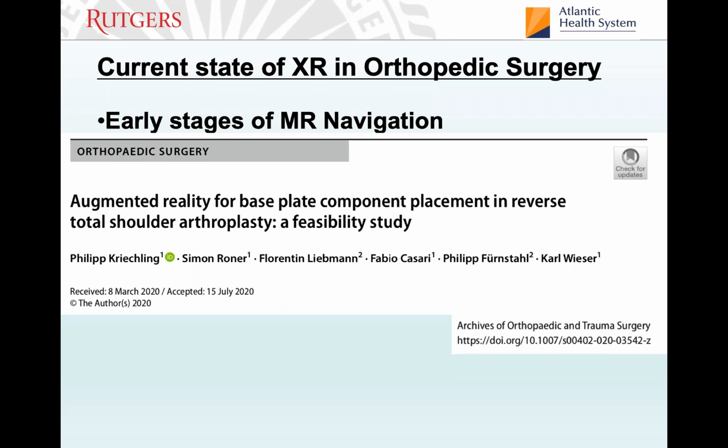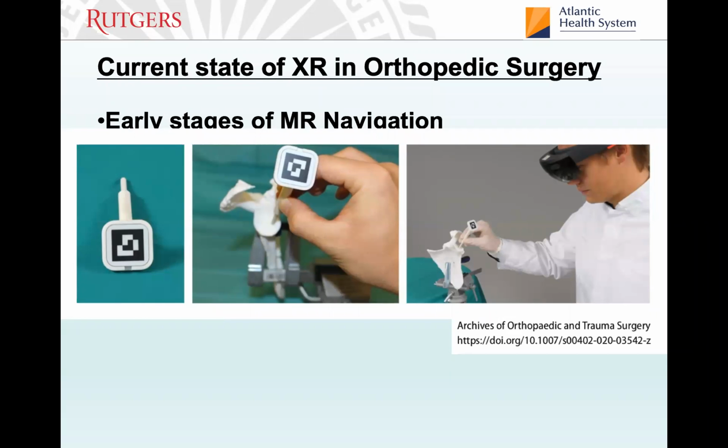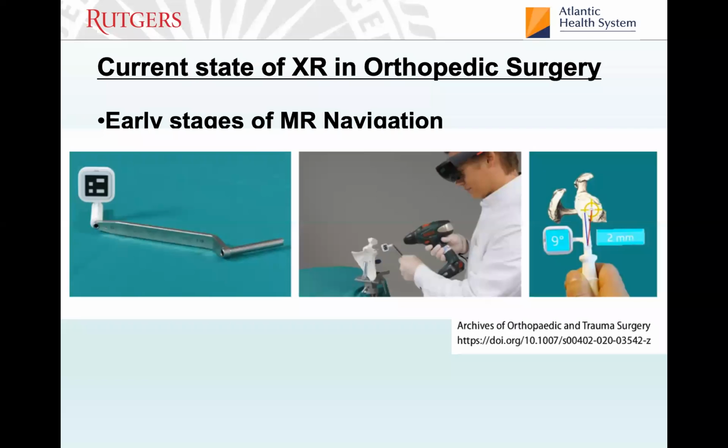This is pretty interesting. They have actually shown, this is from Balgrist in Switzerland, but what they're doing with the HoloLens 1 is they're using this model and taking something they call a fiducial marker, but essentially that's like a QR code, right? They're using this to actually register the anatomy. And then after that, they're using this to basically tell you, in a more navigational way, how far off am I from the anatomy that I've registered? This is the hardest part about any form of navigation. It's actually registering the anatomy accurately that's in front of you.